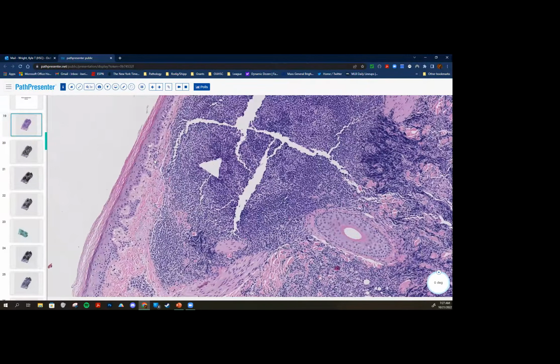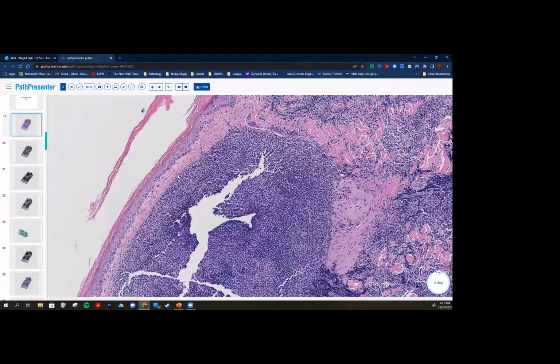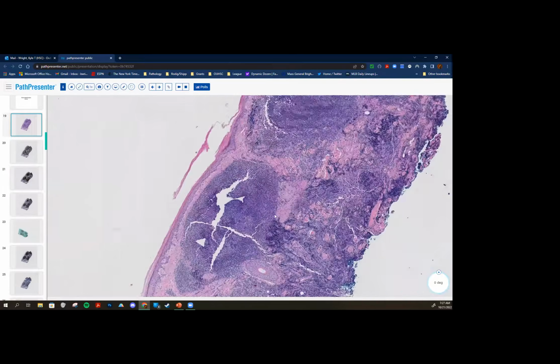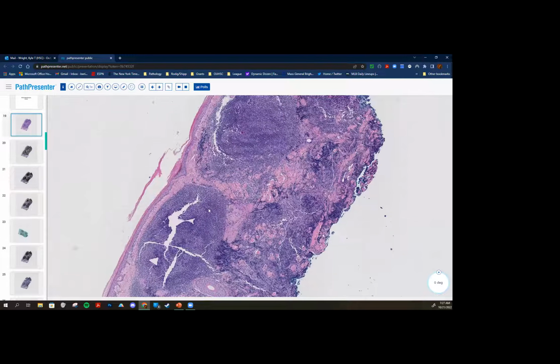And you have this clearing out right underneath the area before the infiltrate begins. It's fairly sharply demarcated like this. This is the so-called Grenz zone or Grenz layer. And this is classic for lesions of this ilk when they involve the skin.